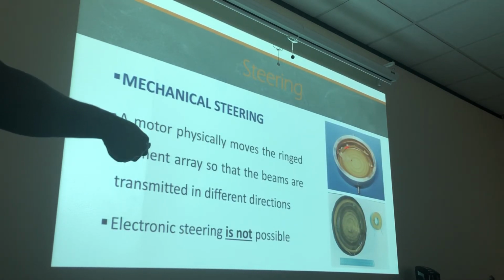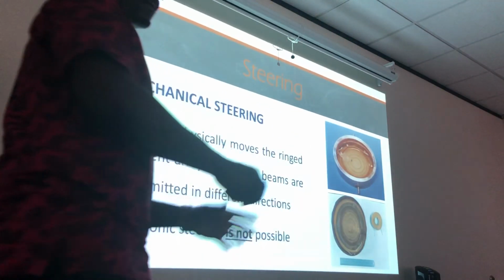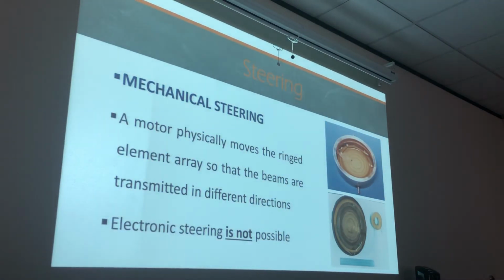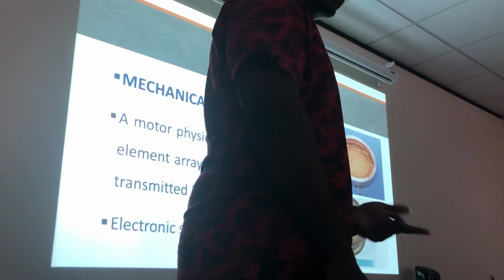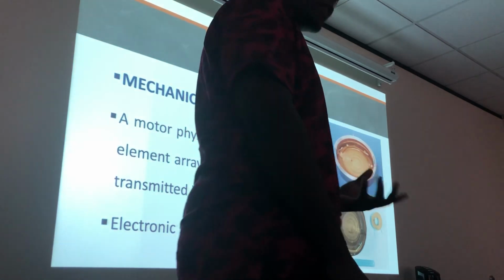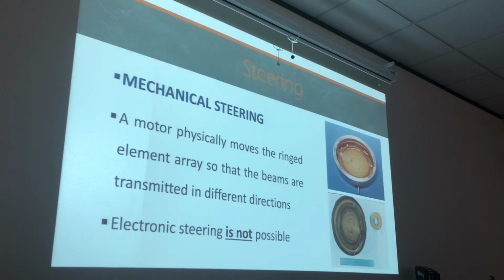So that's what it looks like right here, guys. This is what the elements of an annular phased array transducer look like right there. Okay. Multiple ring shapes. They're not multicolored like the picture suggests, right? Just different shapes, all sharing a common center. Okay. Mechanical steering, guys. This transducer is steered mechanically. It's actually a motor spinning this transducer around. Okay, moving this transducer. A motor physically moves the ring element array so that the beams are transmitted in different directions.